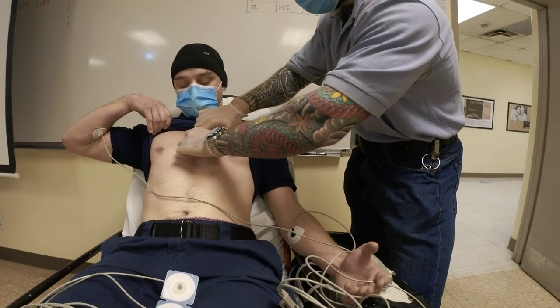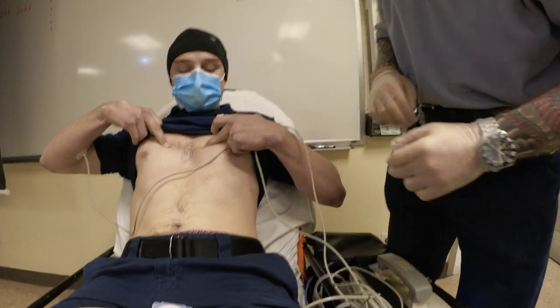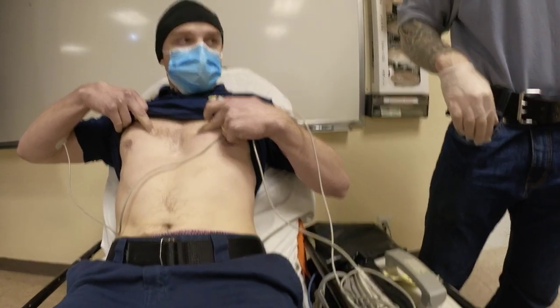Do me a favor for now. I'll put one of your fingers here. And here. So this is the location of your V1, V2, right? Fourth intercostal space, to the left and right of the sternal border.